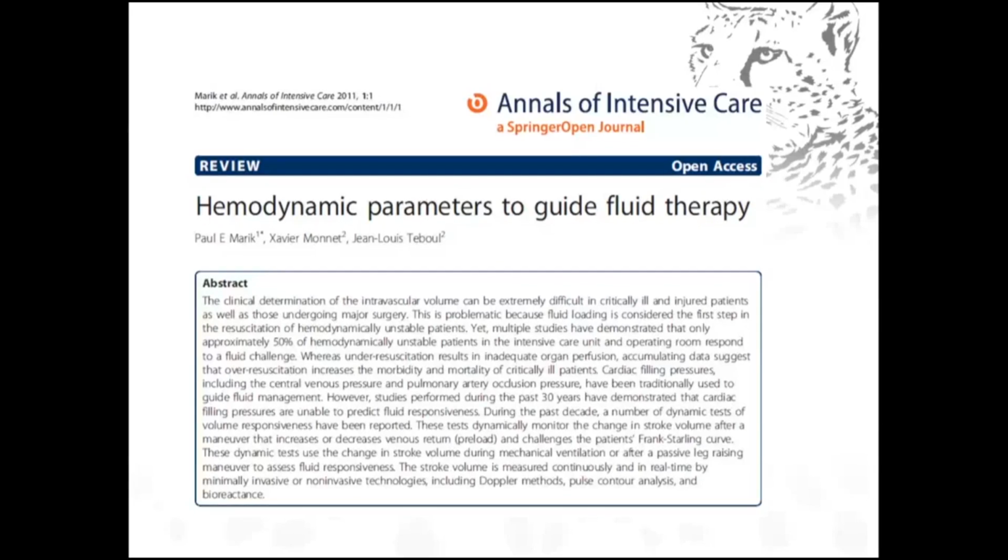What is a dynamic value? A dynamic value or parameter is a measured response of an output, like cardiac output or stroke volume, to a defined stress, which is the fluid bolus. If we look at examples of dynamic values, number one is stroke volume variation. That assesses the changes in stroke volume during mechanical ventilation, or we can assess the changes in stroke volume index when we give a fluid bolus.